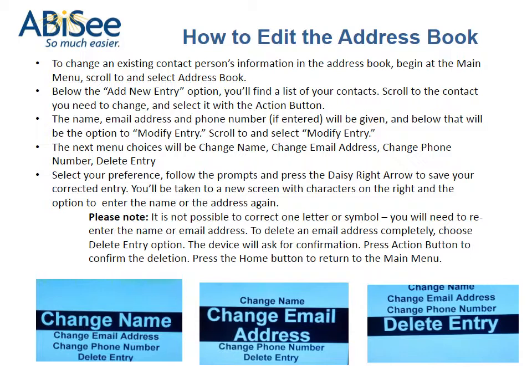You'll be taken to a new screen with characters on the right and the option to enter the name or the address again. Please note, it is not possible to correct one letter or symbol. You will need to re-enter the name or email address.